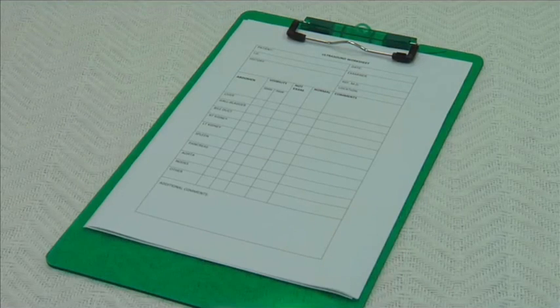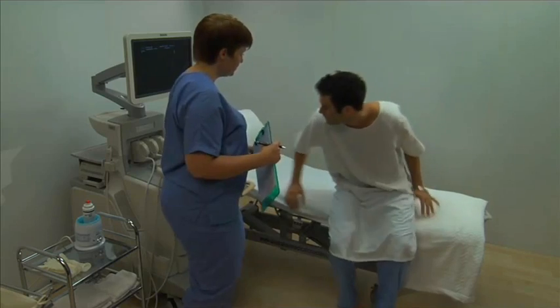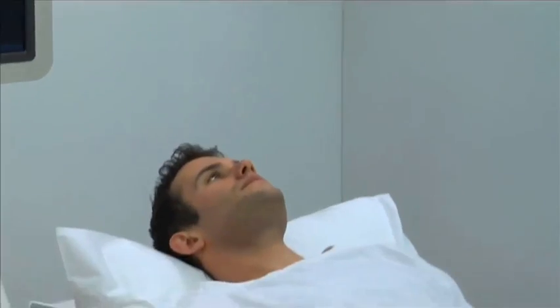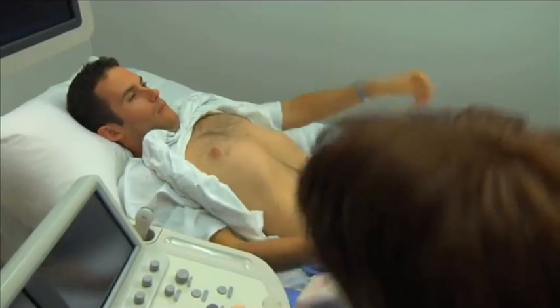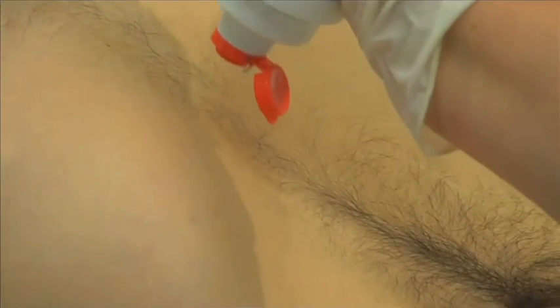Ask the patient to lie supine on the bed and make them comfortable with the use of pillows or wedges, positioned as required. Put on gloves. Expose the patient's abdomen, maintaining privacy where possible, and apply the pre-warmed acoustic gel to the epigastric region.